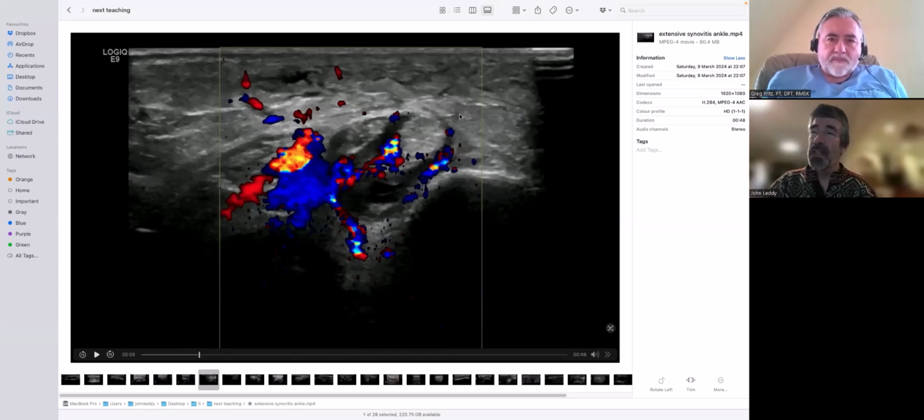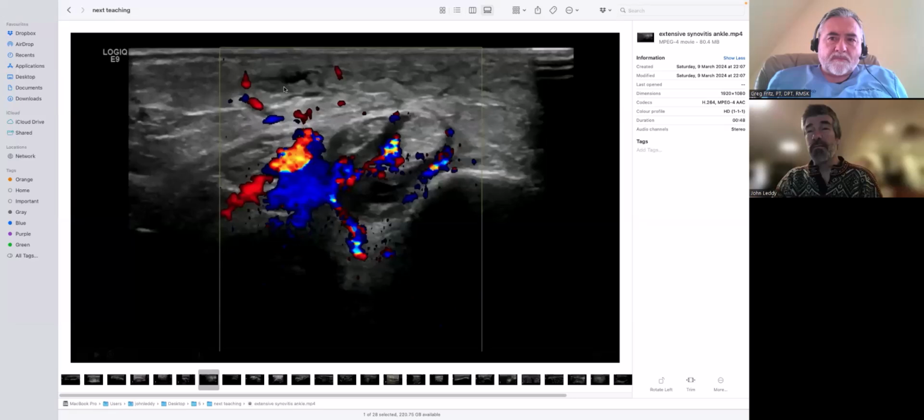So I have, but you want enough so that you don't miss a bit, because often you get inflammation where you're looking for it, but sometimes it's sitting away in a corner and there's some inflammation in the soft tissues or something like that you're really better off picking up, because inflammatory problems in particular can be sort of non-standard, that they don't always obey the rules. The inflammation is not always in the joints.